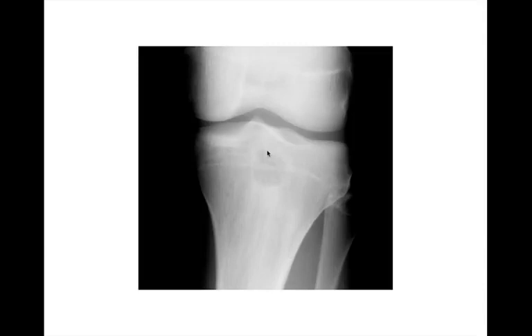Another radiograph of the knee: geographic lytic lesion, narrow zone of transition, sclerotic border, occurring right at the epiphyseal-metaphyseal junction. Part of the lesion is on one side, part on the other. This was actually a Brody's abscess — centrally located in the epiphysis and metaphysis of the proximal tibia.